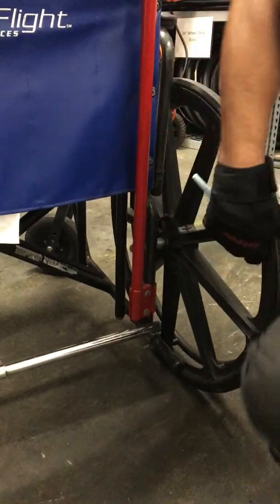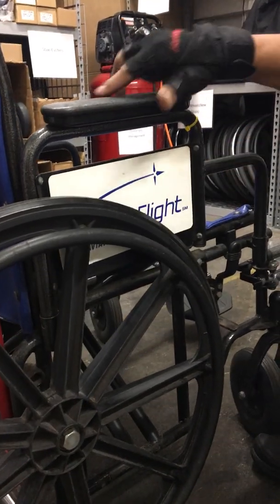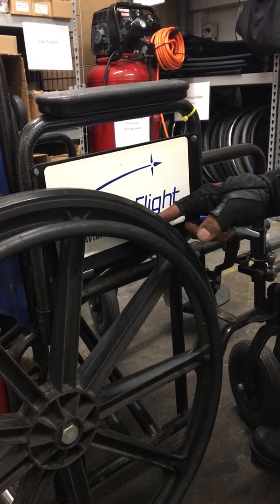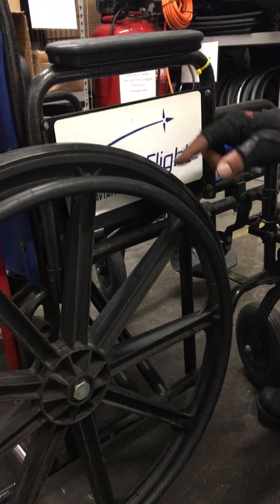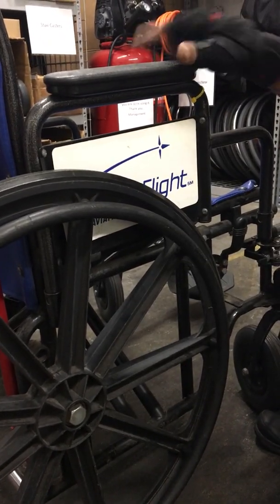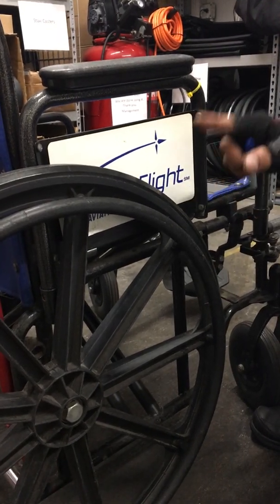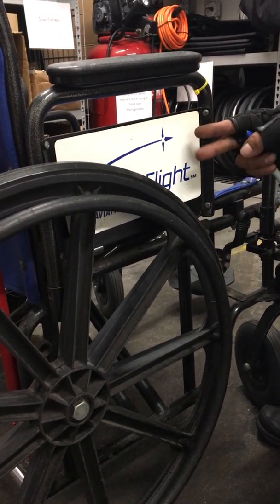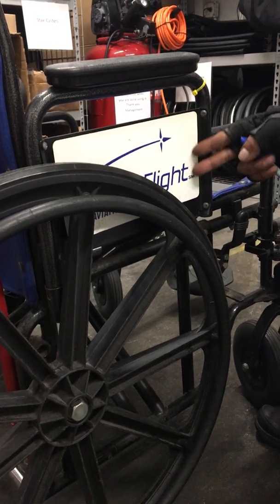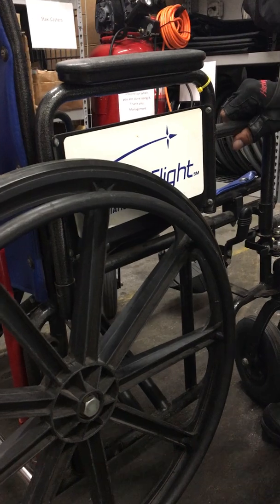Next, I would be inspecting the signs, because the signs are obviously behind the wheel. So it would be right to say change the signs with the wheels at the same time. So the signs would take normally 20 to 30 minutes. The reason for that is because of residues that are left behind. It needs to be taken off. That's why it's 20 to 30 minutes on both sides.